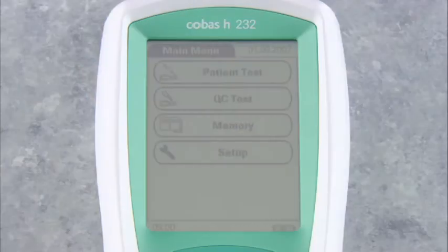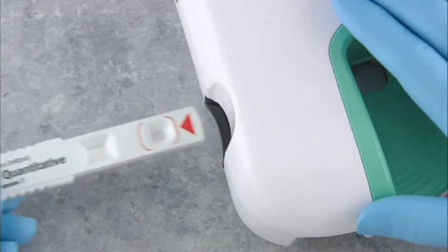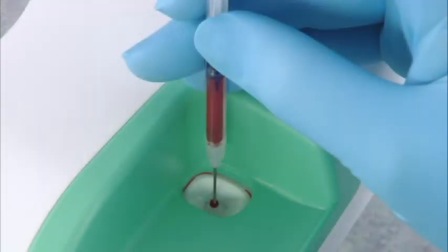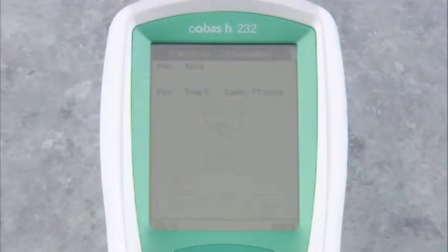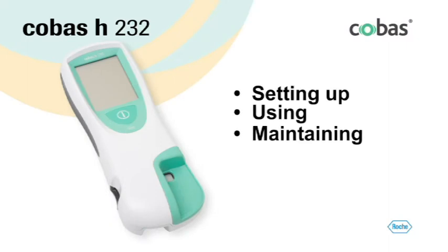The Cobas H232 meter is easy to use. You just insert a test strip, apply the blood sample, and read the result. In this program, we'll look at setting up, using, and maintaining the system.